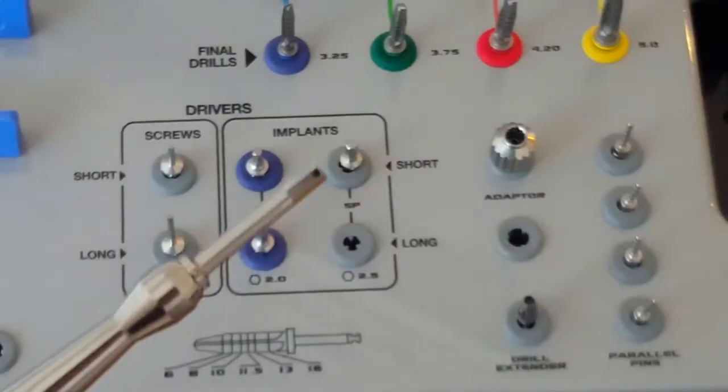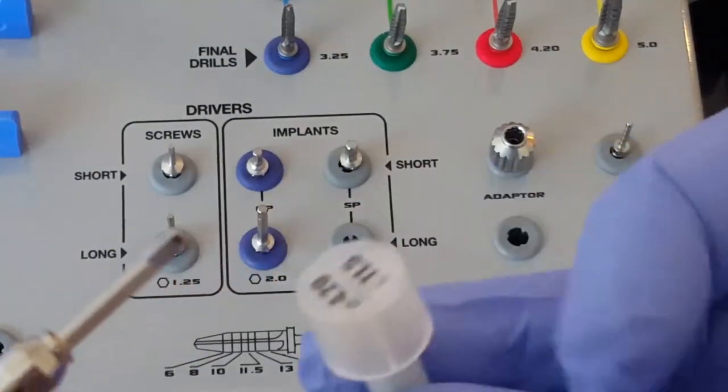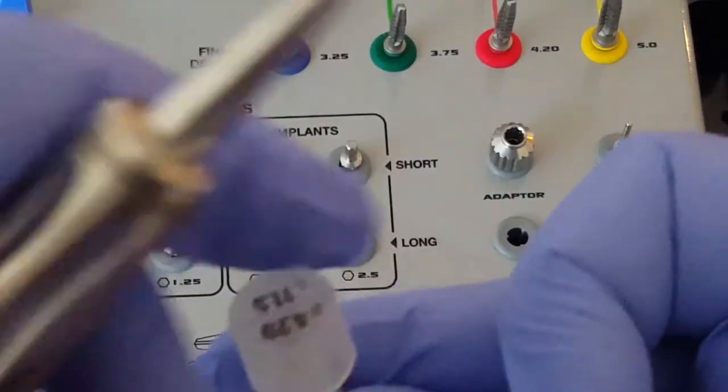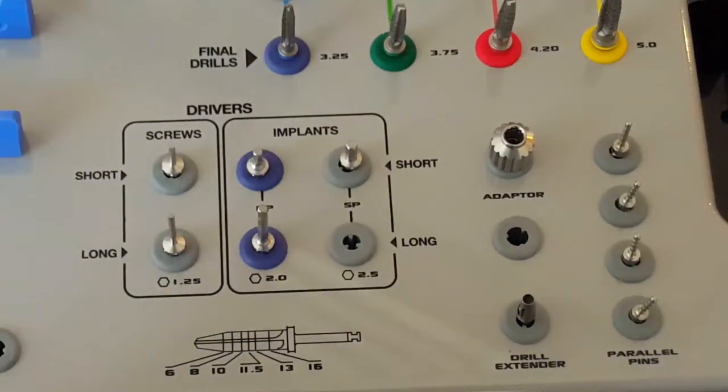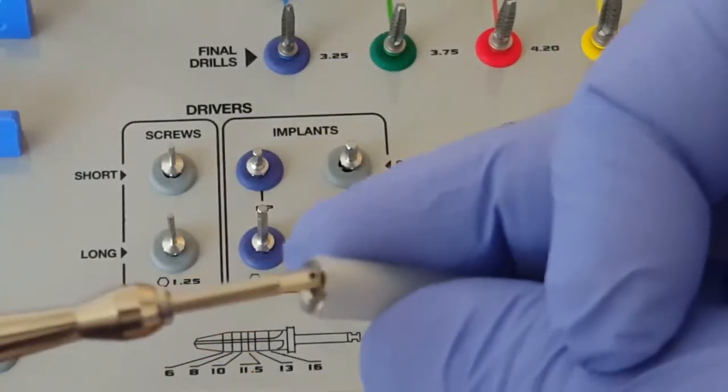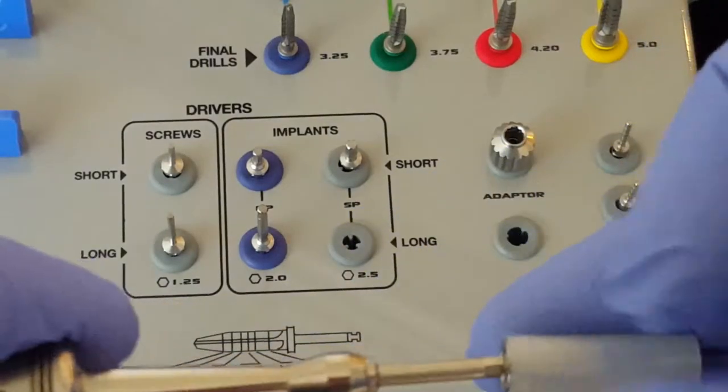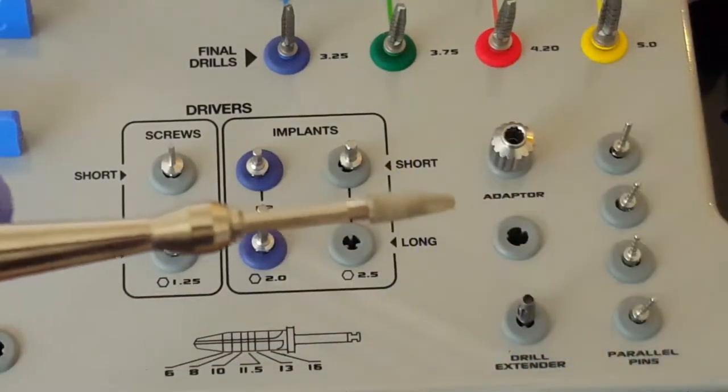So now let's take our vial. Here we are. I'm going to take off the cover, so we're not touching the implant at all. I'm going to insert the key, insertion key inside, and remove it.